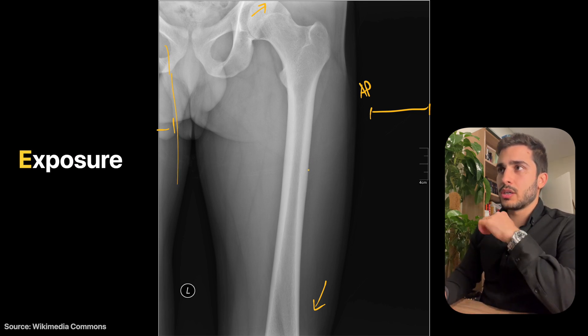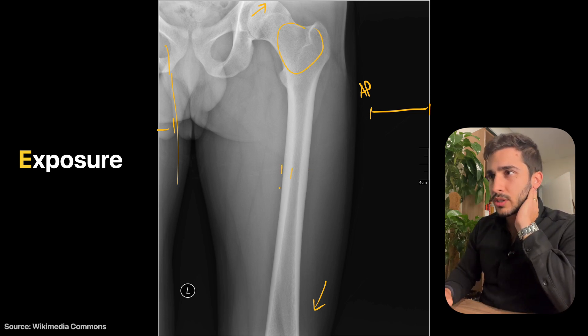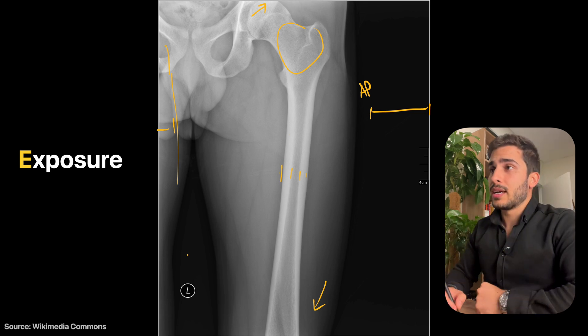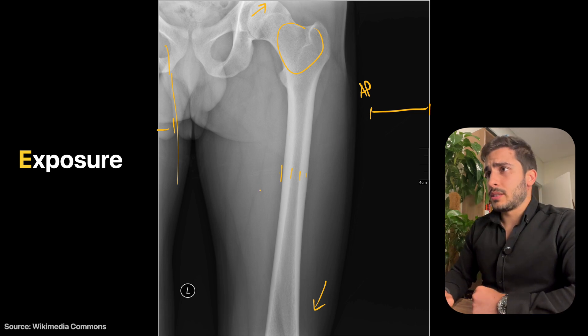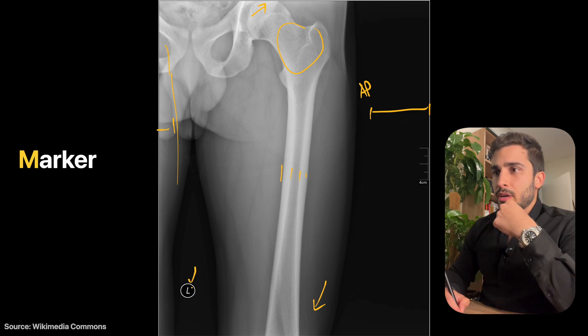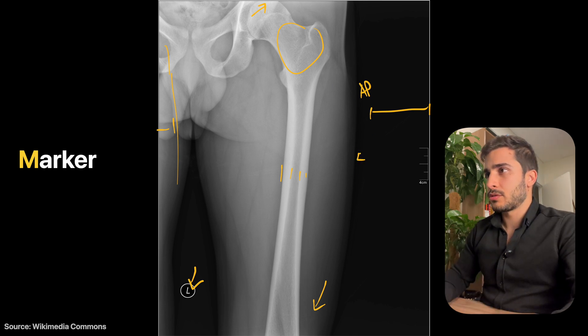In terms of exposure, it's quite good. You can see nice bone texture throughout and the cortex of the bone, which is quite thick — indicating a young, healthy male. Penetration and contrast levels are good, so I wouldn't change anything with the exposure. There is a left marker present, which is correct; ideally though it should be placed on the lateral side closer to the anatomy.